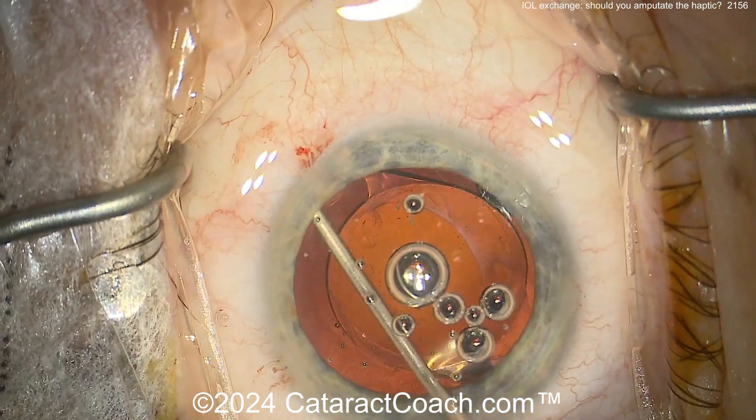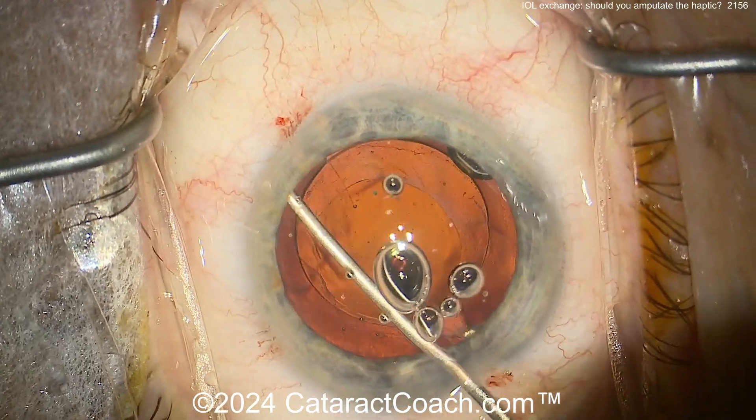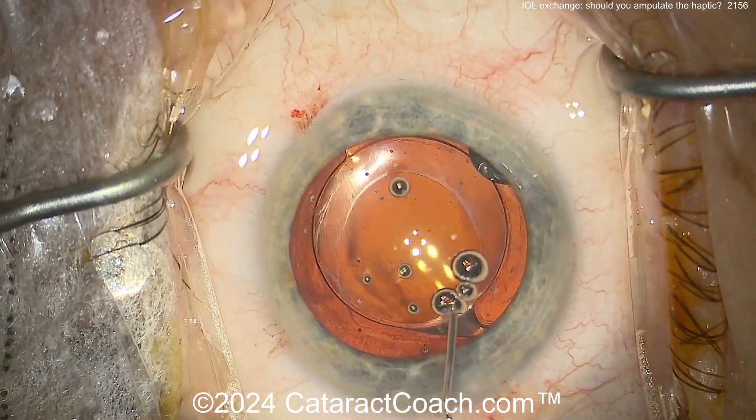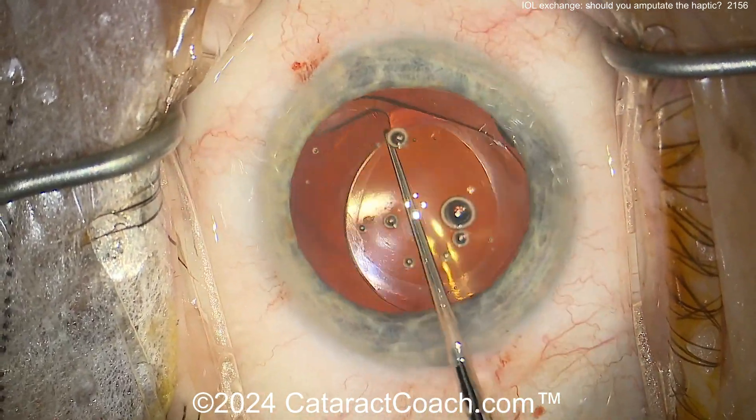The question is, what can you do here? How do you dissect it more? I like more viscoelastic, maybe a little bit more blunt dissection, taking your time. But again, sometimes you just can't free it up. Now I'll show you what we're going to do in this case, which is going to be amputation.